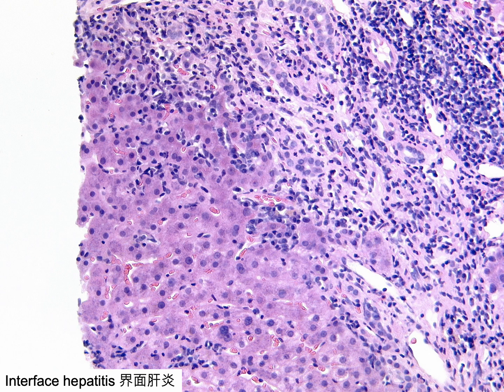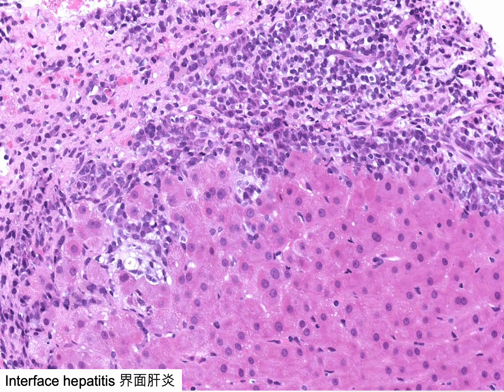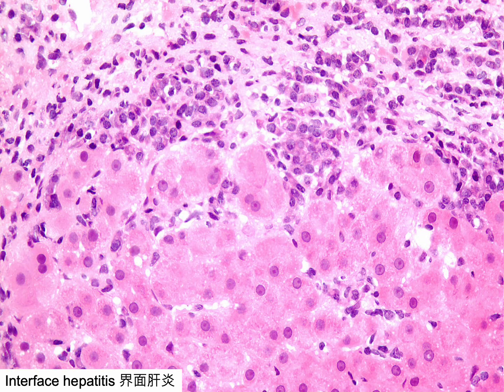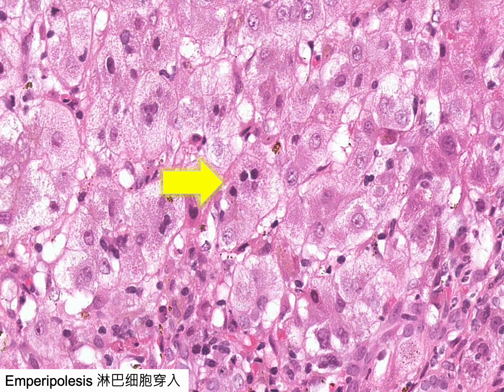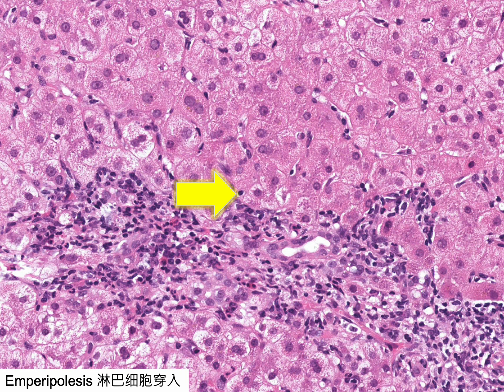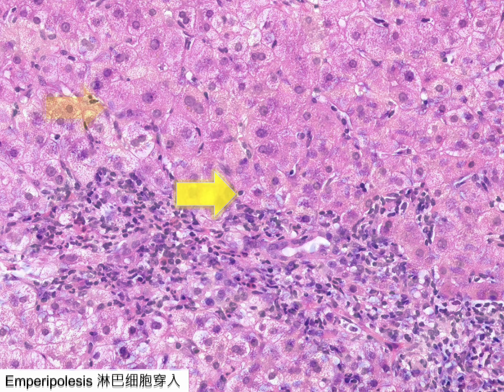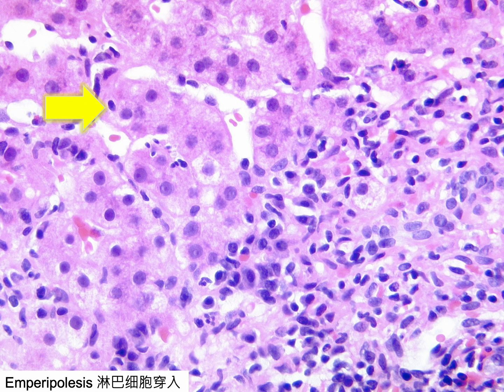Lymphoplasmacytic cells breach the interface between the portal tract and liver parenchyma, encircling individual and small clusters of periportal hepatocytes. This feature is interface hepatitis, previously known as piecemeal necrosis. Emperipolesis is characterized by the engulfment of lymphocytes by hepatocytes in the periportal region and has been regarded as one of the typical histological features of autoimmune hepatitis. Emperipolesis is not uncommonly accompanied by interface hepatitis.